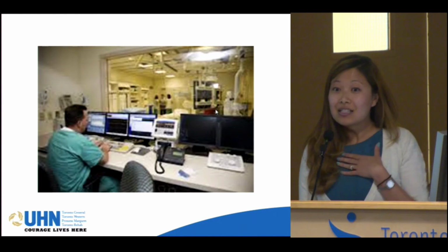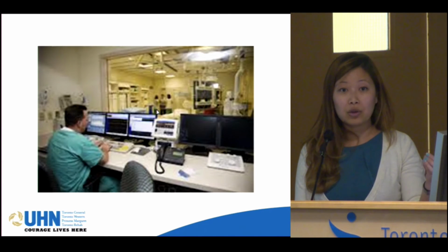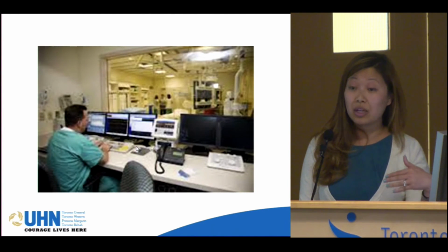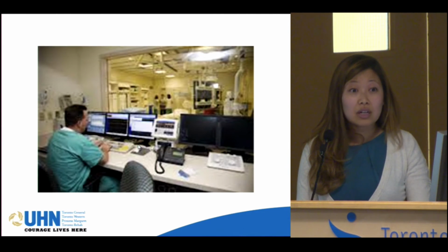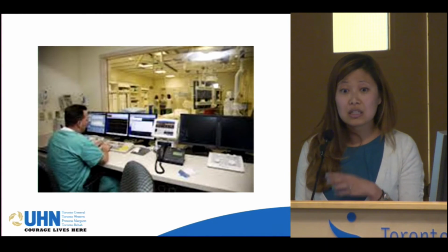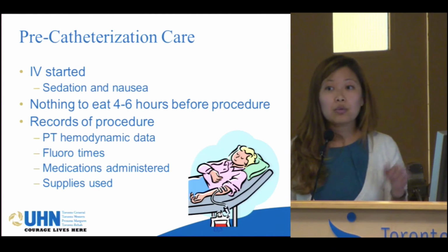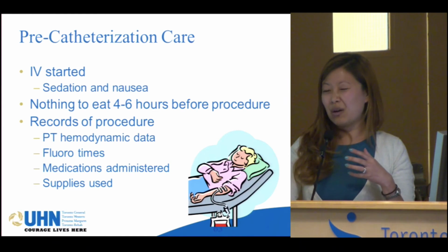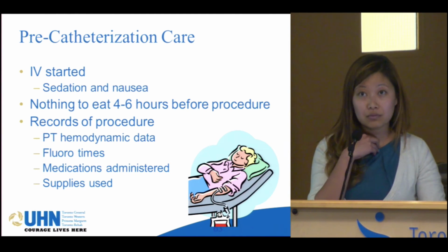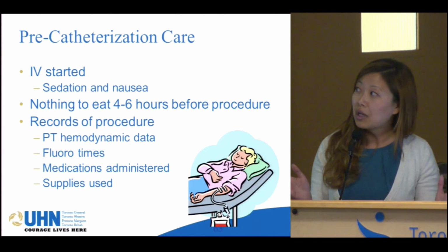So for us, there are some techs in there with the doctor. We're either standing right by the doctor to help with which wires to hand them, or there are some people standing behind the screen so that they don't get x-rays, and they check your heart rate. They just make sure your ECG is going okay. They check your breathing, and make sure you're stable, because it is a very invasive procedure. All the tests that have been talked about before, we don't actually go into the body, except if you count swallowing that transducer for the transesophageal ultrasound. So here we're breaking the barrier. We need to prep you and make sure everything's ready.